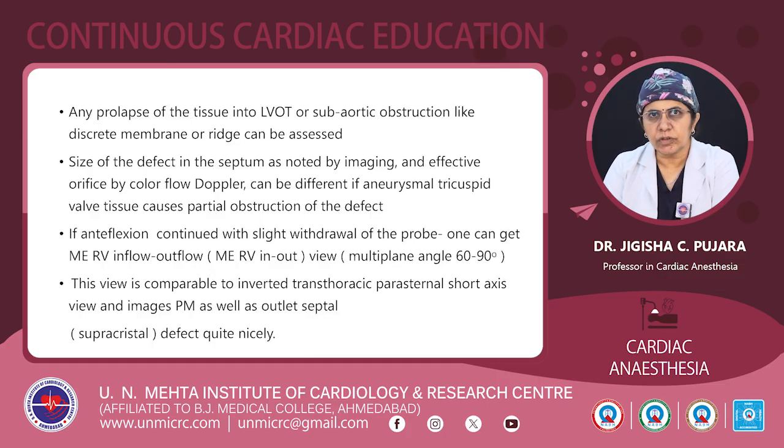Any prolapse of tissue into the LVOT or subaortic obstruction, like a discrete membrane or ridge, can also be visualized in this same view. The size of the defect in the septum as noted by imaging and the effective orifice by color Doppler can be different if aneurysmal tricuspid valve tissue causes partial obstruction of the defect.